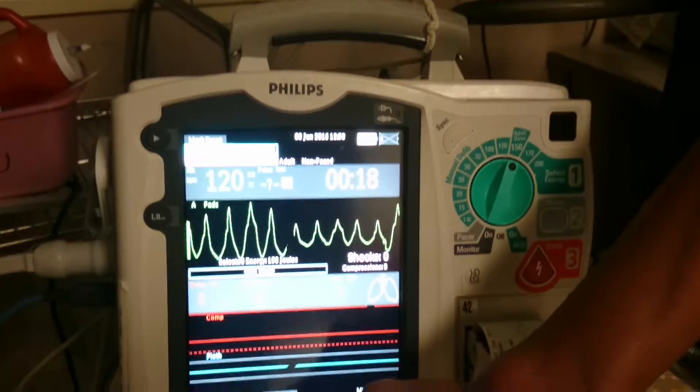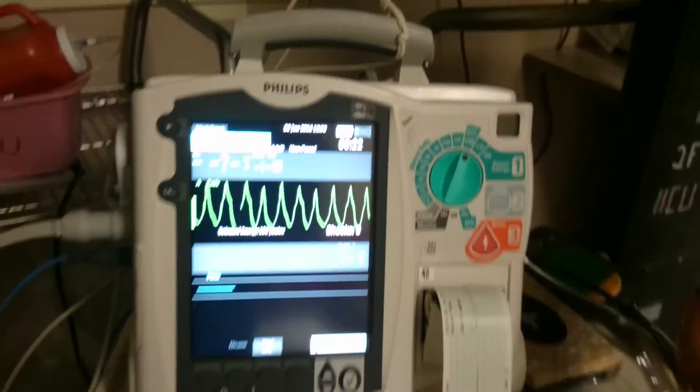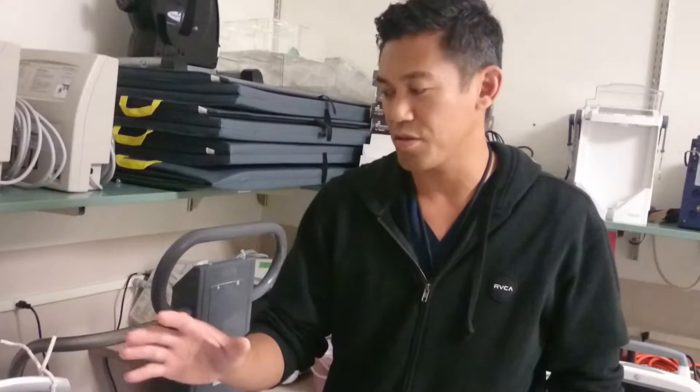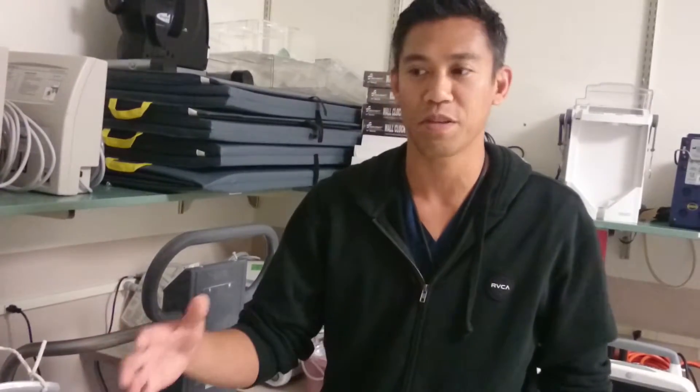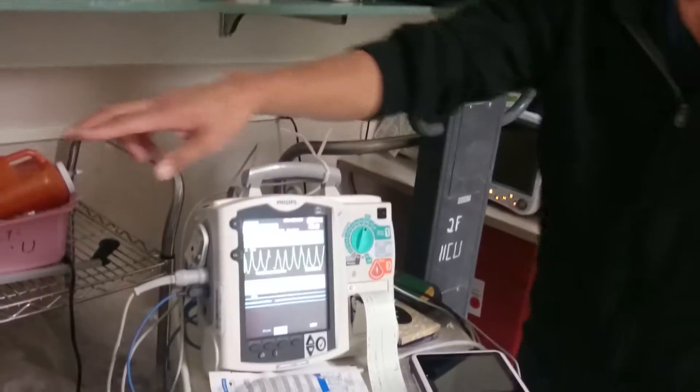One thing you want to keep in mind: if it's a witnessed arrest — the patient goes pulseless in front of you — you want to shock right away. There's no need to do compressions first, because the perfusion is still adequate. For example, if they were just talking to you and all of a sudden this rhythm shows up on the screen and you check them and they have no pulse.